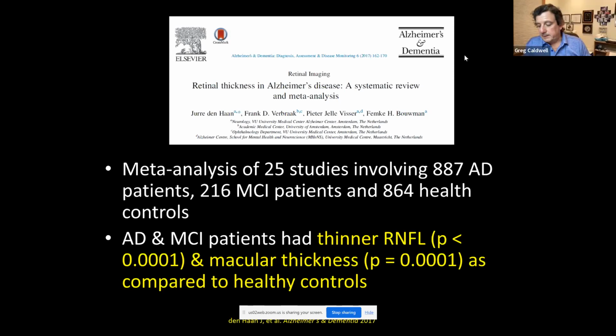Yeah, that's a great point. And now I'm just going to wrap up by echoing and saying it a different way is, retina is brain, right? The retina is the brain, neurons. And that's why you're seeing these changes OCT wise and understanding the pathways. You hear a lot about nutrition in the brain going back and forth. So just remember, retina is brain, and you'll understand why OCT is very valuable in these neurogenic disorders.